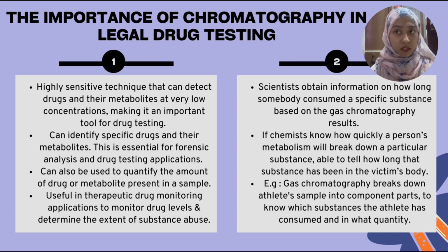Digging a little deeper, scientists can also obtain information on how long somebody consumed a specific substance based on the gas chromatography results. If chemists know how quickly a person's metabolism will break down a particular substance, for instance, they may be able to tell how long that substance has been in the victim's body.